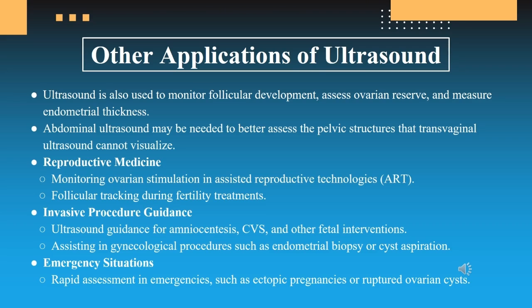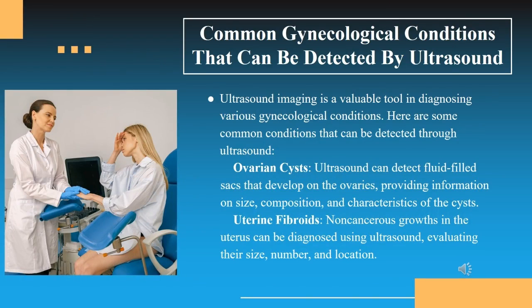It helps assist in gynecological procedures such as endometrial biopsy or cyst aspirations. And in emergency situations, requiring rapid assessment such as ectopic pregnancies, ruptured ovarian cysts and ovarian torsion, it can diagnose immediately.